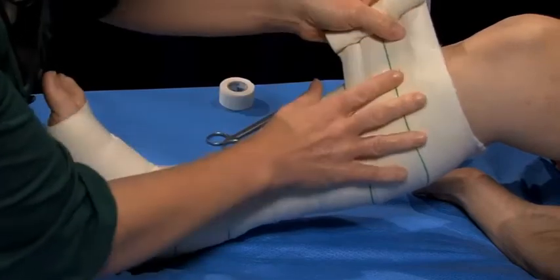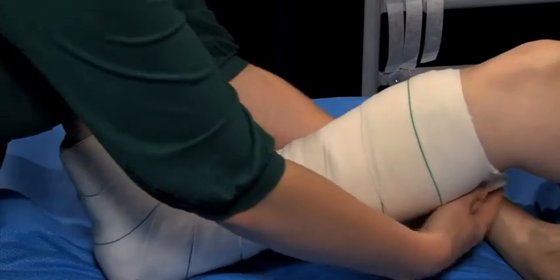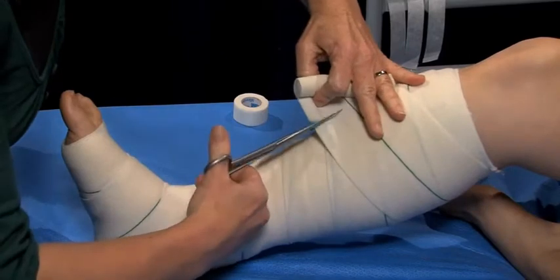Finish bandaging two centimetres below the crease of the knee and cut off any excess bandage before fastening with tape, or secure the remaining length of bandage without tension.